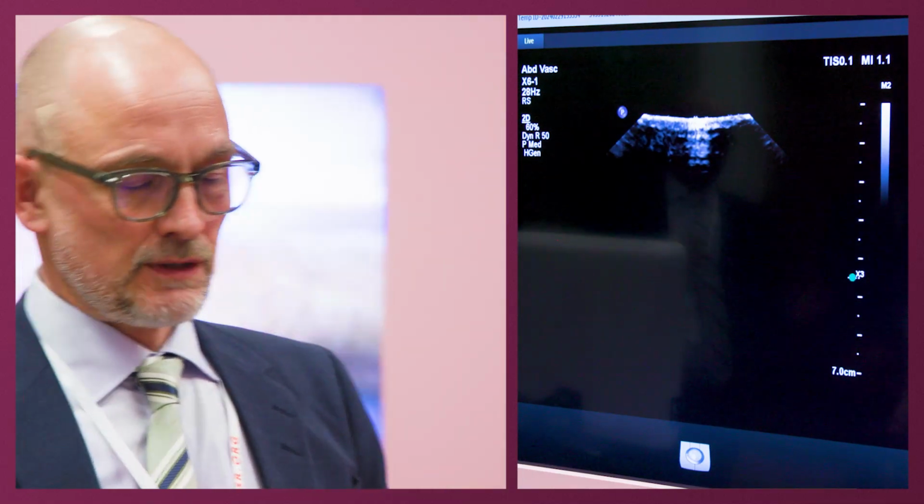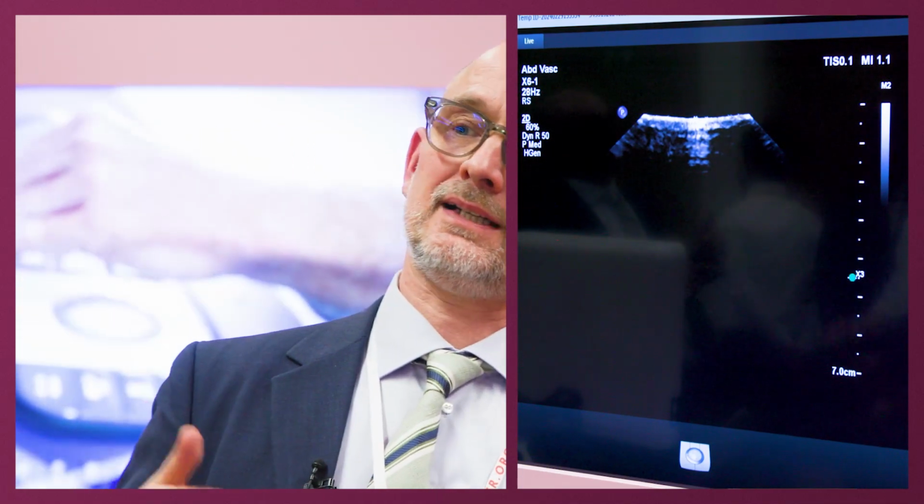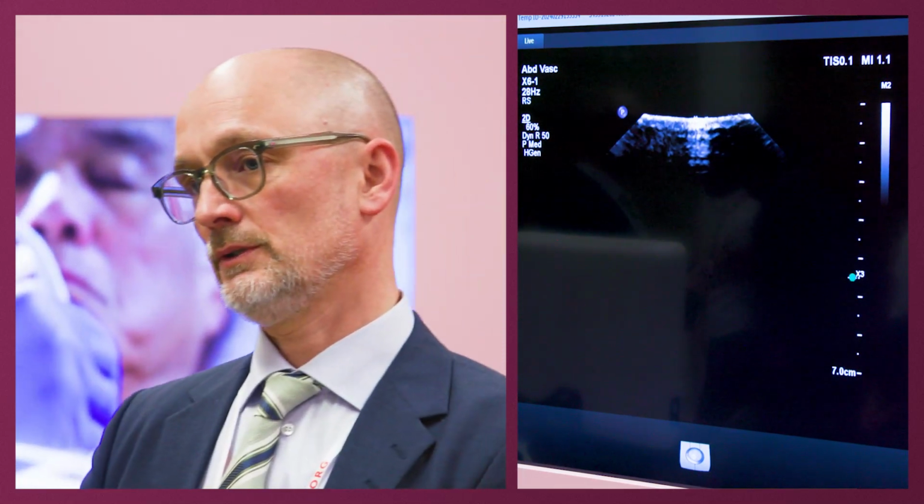There's a kind of random forest running, a kind of machine learning. It was not tested on non-aneurysm, it's not designed for non-aneurysm patients. It's especially designed for patients with aneurysm. And that's very important because you follow them up, you have repetitive scans, and at a certain point, you send them to CT and surgery on the right spot.